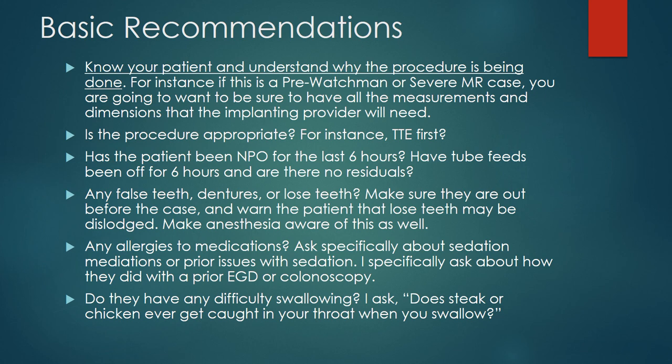I always ask these questions for each of my patients: have they been NPO for 6 hours? Have the tube feeds been off for 6 hours and checked for residuals? Always ask if there are false teeth, dentures, or loose teeth. Make sure that these are out before the case. Do not rely on nursing or anesthesia to do this for you.